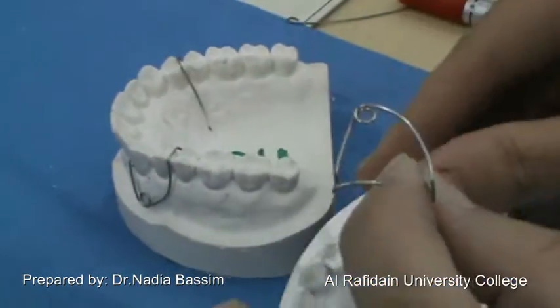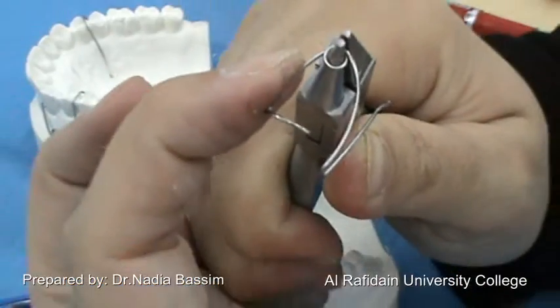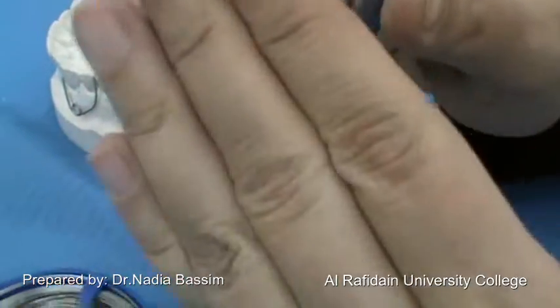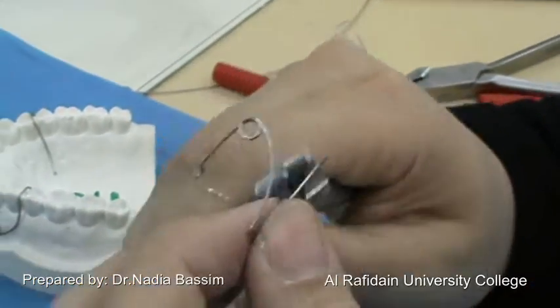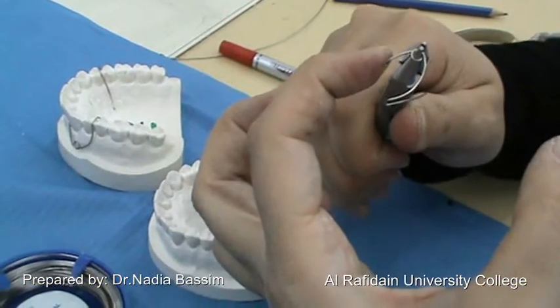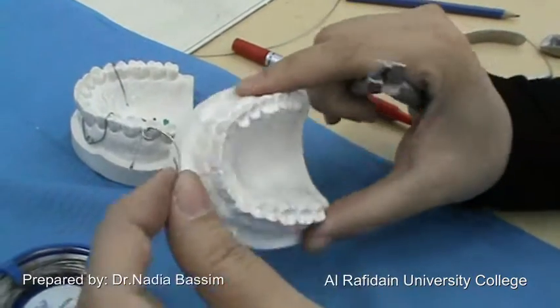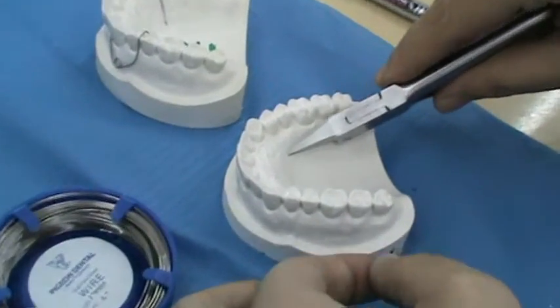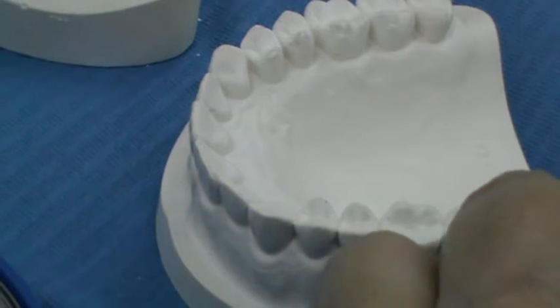Regarding the activation of the PCR: it is done by squeezing the coil. For the modified PCR, we also need to add a palatal movement to the C-clasp to push the canine not only distally but also in the palatal direction. While for the simple PCR, activation is done only by squeezing the coil. In general, any spring located buccally should be activated by closing the coil, while springs situated palatally are usually activated by the opposite — by opening the spring, just like the finger spring.